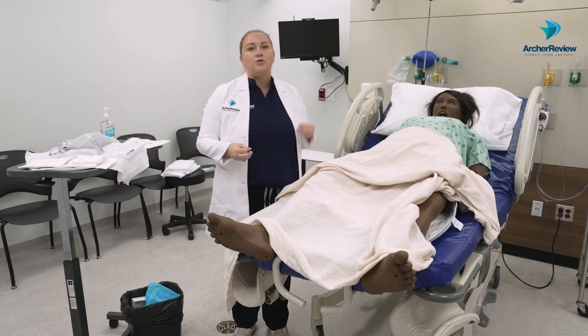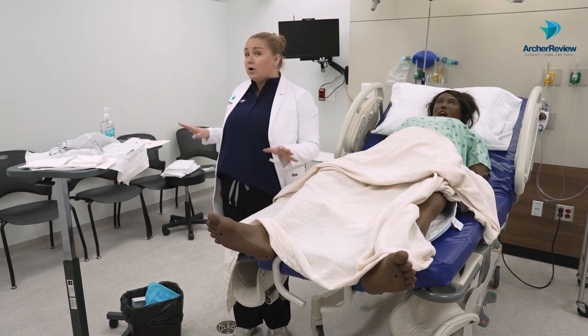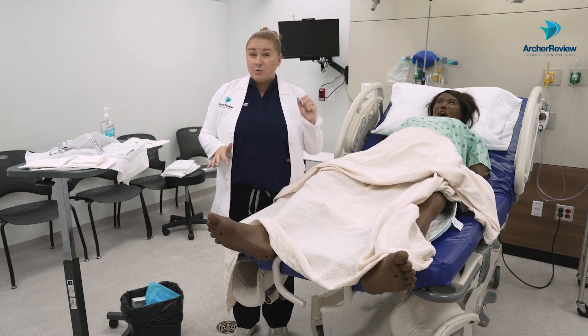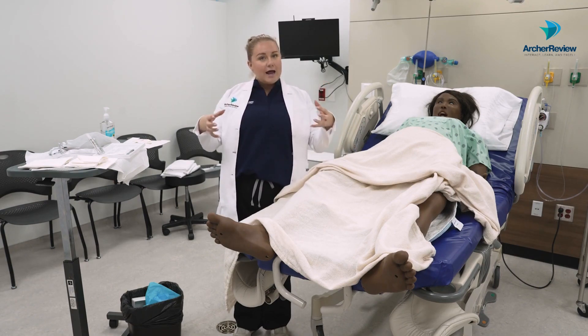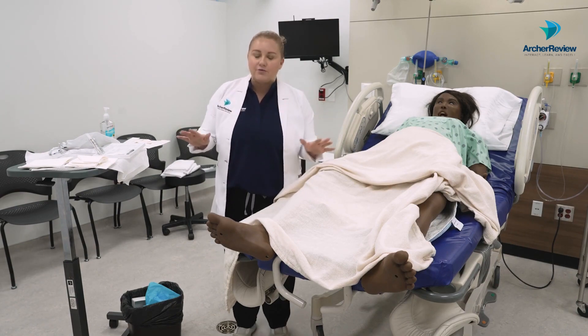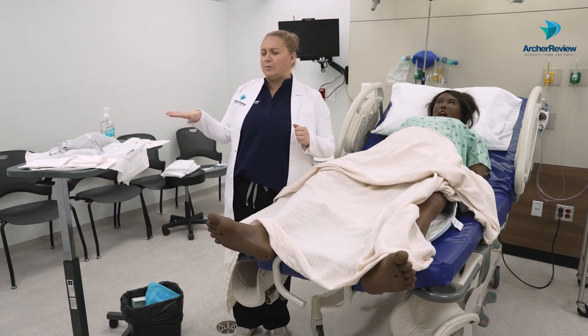We are of course going to verify our provider's orders, double identify our client, and gather all the supplies you need before you come in the room. This one does have quite a few supplies. Usually you can get a Foley catheter insertion tray that has most of the materials you need, but always verify once you're getting going that you really do have what you need.